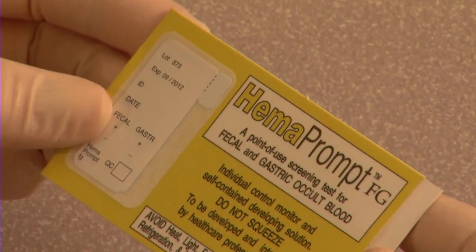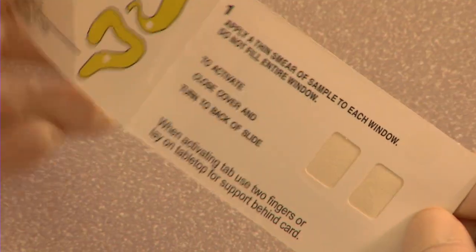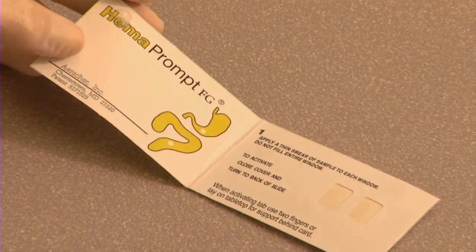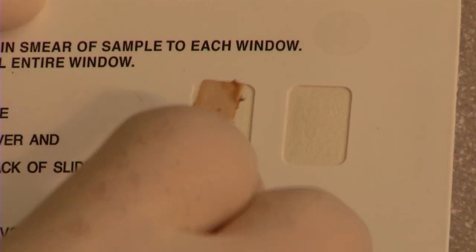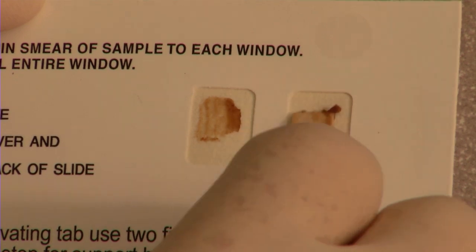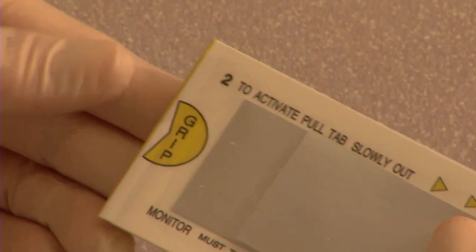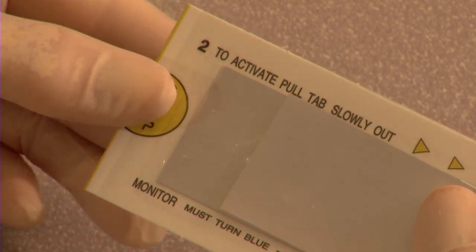This is how easy it is to use HemaPrompt FG. Start with the front of the test card facing you, and lift gently to open. Apply a thin smear of specimen to each one of the sample windows. Don't cover the entire window — leave a little white around each smear. Close the card and turn it over. Grip where indicated with your thumb, and place two fingers behind the card for support.